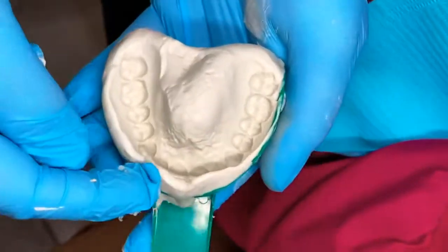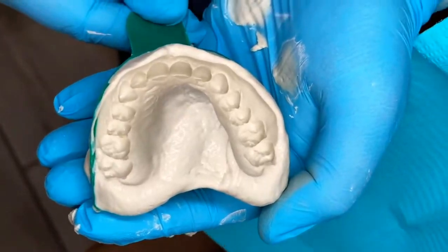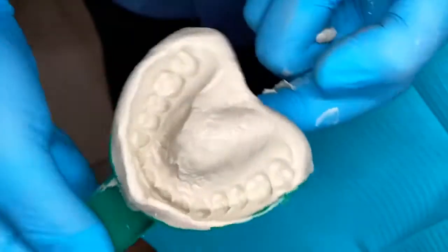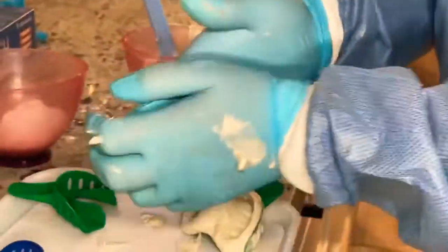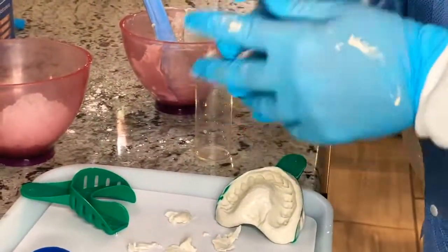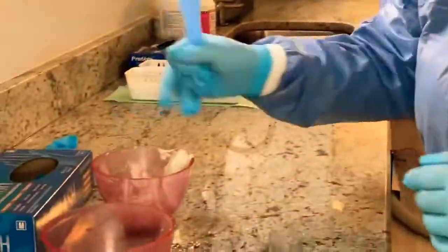This is the extra material for the lip roll. We have all of her teeth in there. This is her palate — I have a little space here. It doesn't look so bad; it'd be good for study models or bleaching trays. We're just going to sit here for a moment and then we'll pour them up. The spatula can be cleaned by just a paper towel wipe — nice and clean to go on to our next impression.